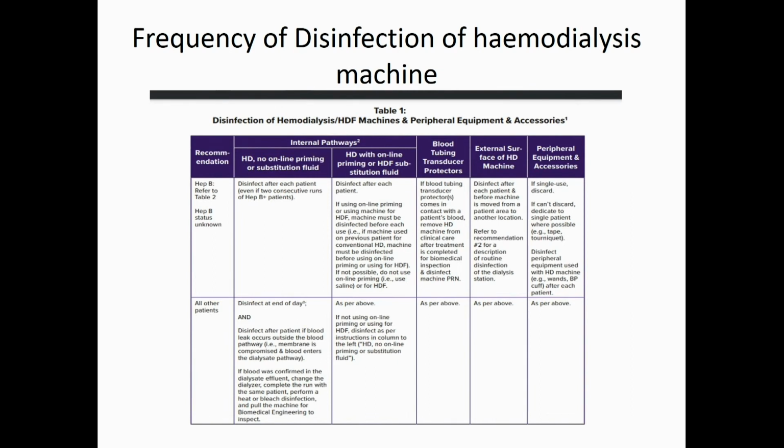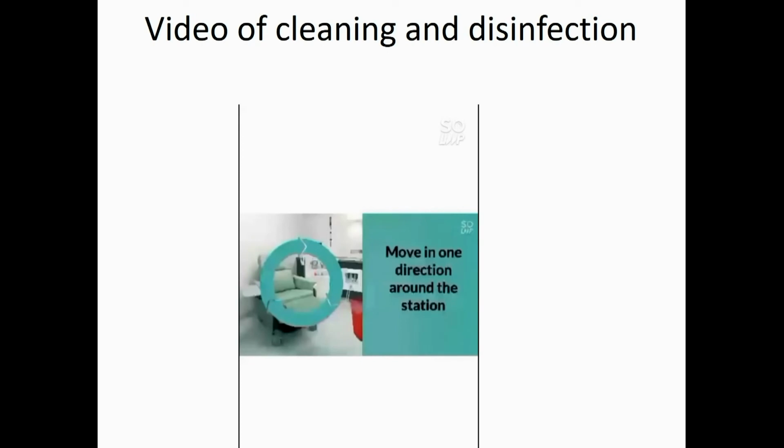There are certain parts of the hydraulics which are metal, and if that metal comes in frequent contact with hypochlorite, it's going to get damaged. But citrosteril per se, at least once a day. Between sessions, heat disinfection.